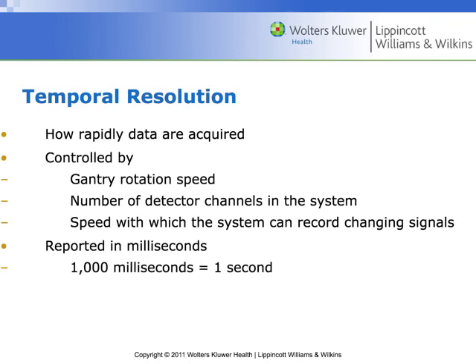All right. Temporal resolution. Sometimes the word temporal, we think about the temporal bone or something like that. Temporal, she talks about in the book, can also be used to indicate time. So what this is talking about is timing resolution, right? And the major thing that impacts this is how rapidly the data is acquired. So with the early CT scanners, we were very interested in increasing their scan speed, because as we increased their scan speed, we were going to have increased temporal resolution.